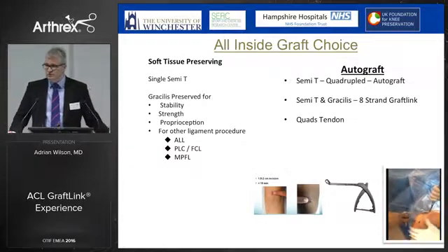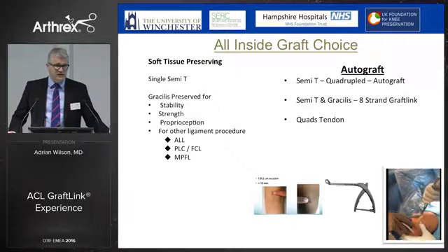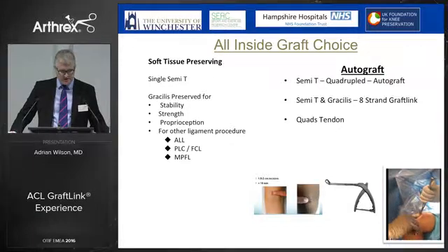This is a very clever tool. This is a minimally invasive way of taking a quads tendon, which I think is a very good option for the revision procedure. And this is something I advise you to take a look at on the stands outside.